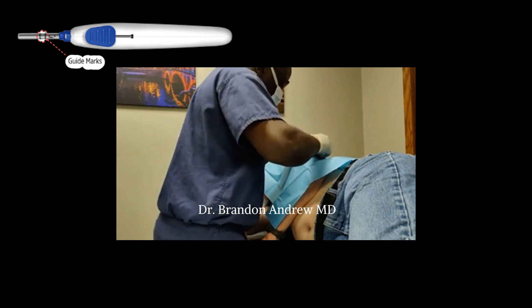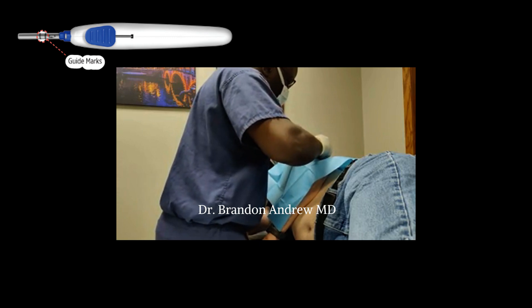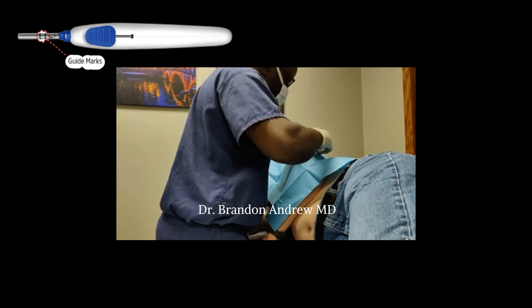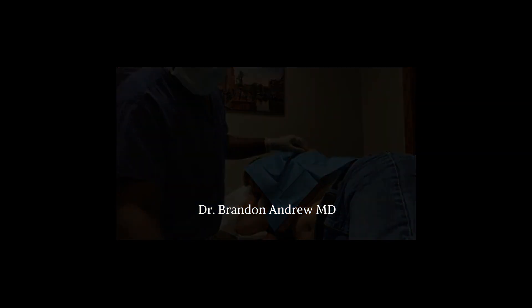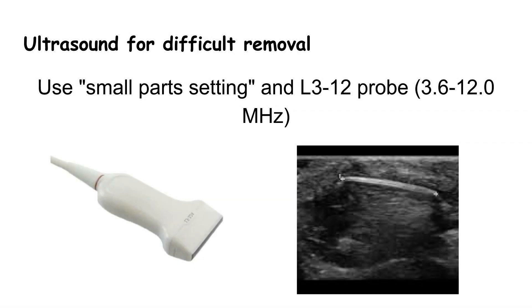All of the procedure steps are done parallel to the patient's skin — you don't want to dig down and place the sensor on an angle. If you cannot palpate the sensor, there are a few techniques you can try. Ultrasound is an effective tool for locating the sensor which could facilitate removal; I would use the small-part setting and a broad-spectrum linear probe. You could also consider using x-ray if you cannot visualize the sensor using ultrasound. However, it would be rare to need this, especially if the device was placed well to begin with.